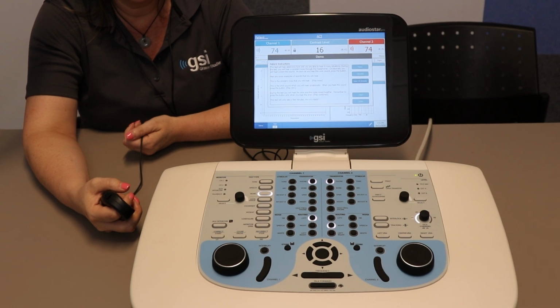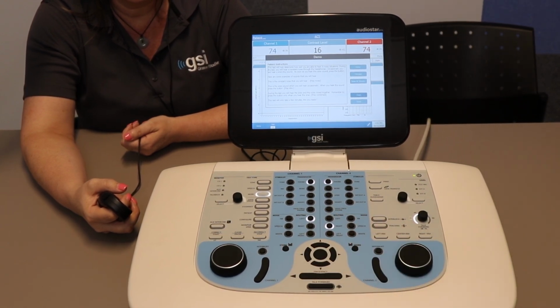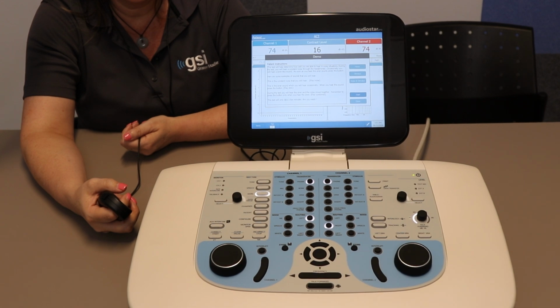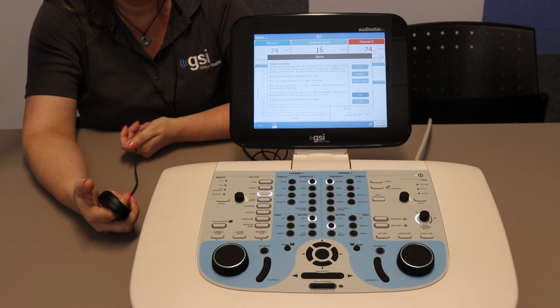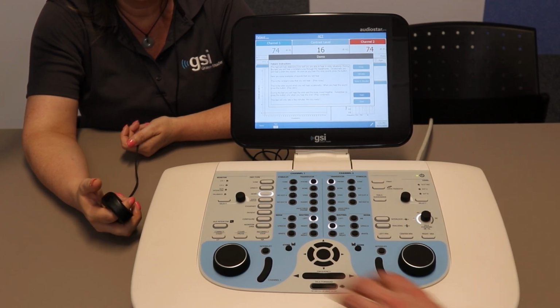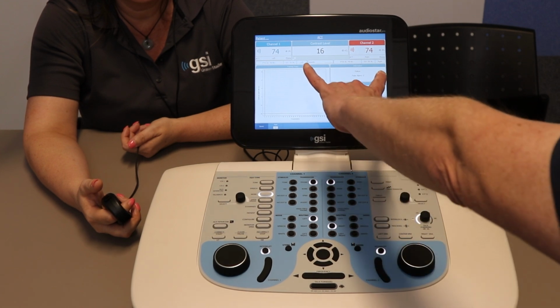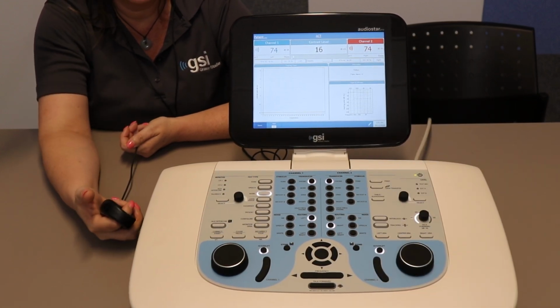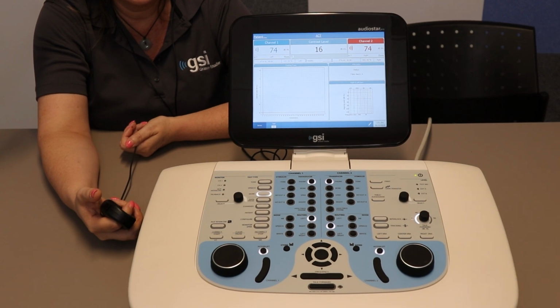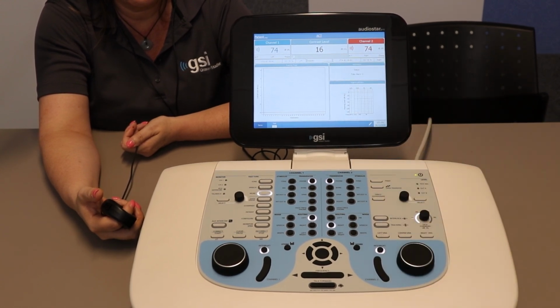And the idea is now we are going to begin the test. Once I hit start, you're going to see both of the interrupts turn on and the audiometer immediately becomes engaged. It's going to start playing the background noise, and that will continue throughout the entirety of the test. So let's get started. You can see the interrupts are engaged, and both channels are engaged. They're both equal right now because we put in a flat loss on both sides, but you might see some variation in that intensity. The test starts out at a contrast level of 16.